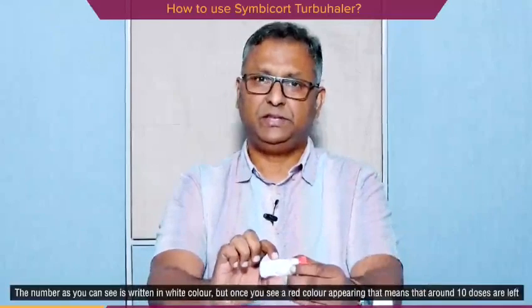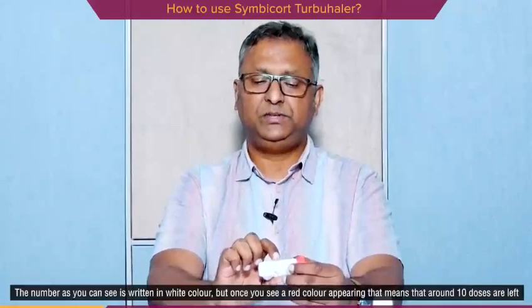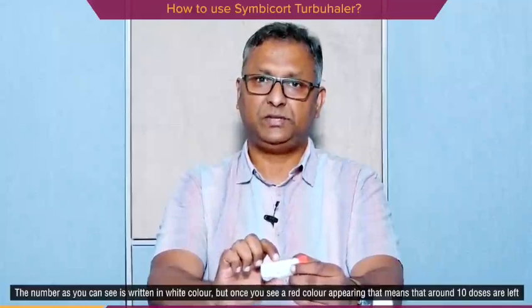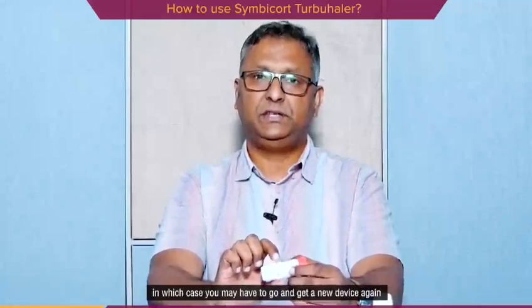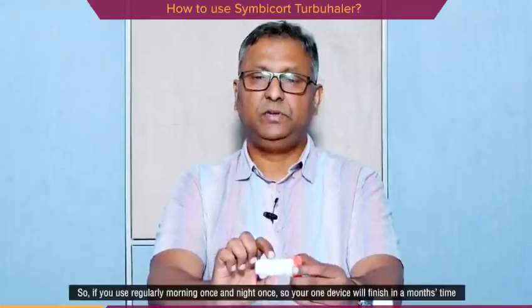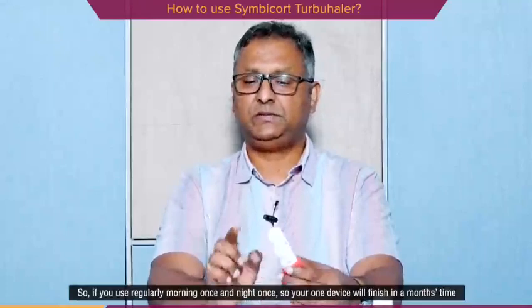The number, as you can see, is written in white color, but once you see a red color appearing, that means that maybe around 10 doses are left, in which case you may have to go and get a new device again. So if you use it regularly, morning once and night once, one device will be finished in a month's time.